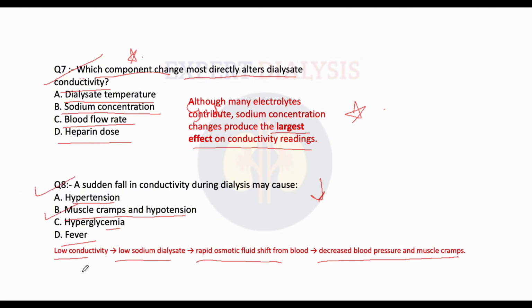Again, you can see low conductivity means low sodium dialysate. Low sodium dialysate means there will be movement of sodium out from blood into the dialysate. So sodium concentration inside the blood will be lower, and when there is lower sodium concentration, it will eventually cause muscle cramps.